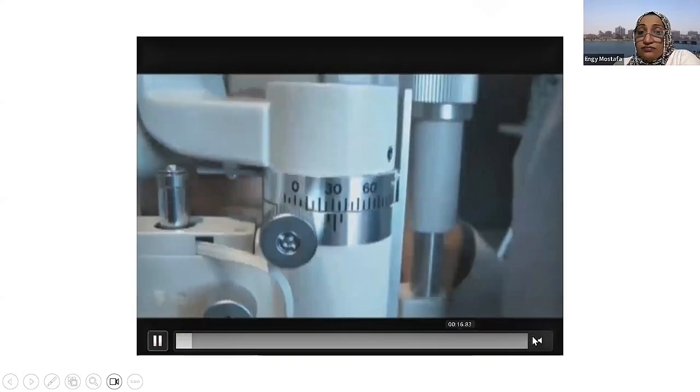So here, this is the only examination in the slit lamp where you can change the place of the viewing system and make it fall on the same part, and then you have to use monocular vision to see the reflection of light. If you are examining a mirror, there will be only one point of reflection. But if the surface is very irregular, you would see multiple diffractions of light from the irregular surface. That's what we are looking for, especially at the endothelial cells.